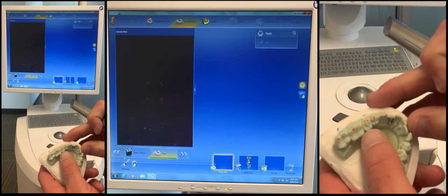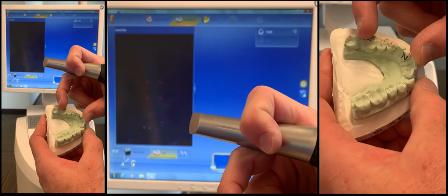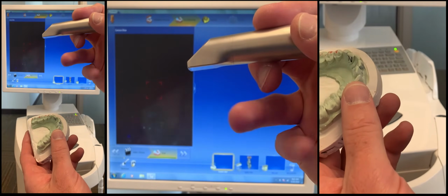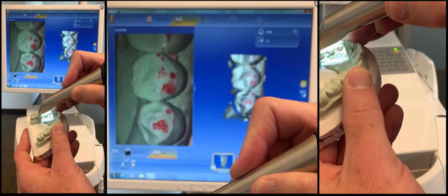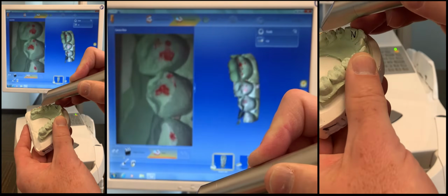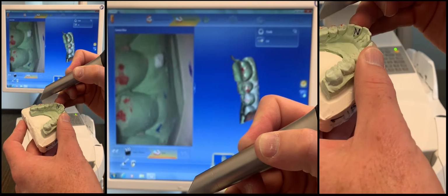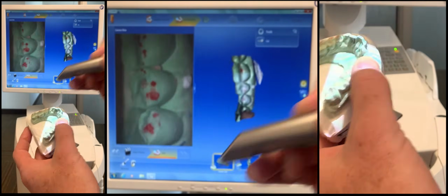And remember, we're working on tooth number 13, so I need to scan basically this little segment of the jaw. We don't need to scan the whole thing, I just need the opposing teeth and to make sure I have a clear image of the buccal. So again, remember your fulcrum. Then we're going to position in the focal depth, and we're going to just get a little bit of this data here. And always remember, try to avoid dragging the camera lens over the surface of the teeth.